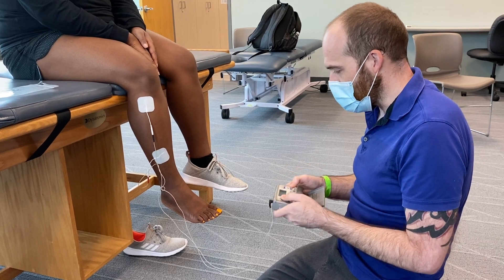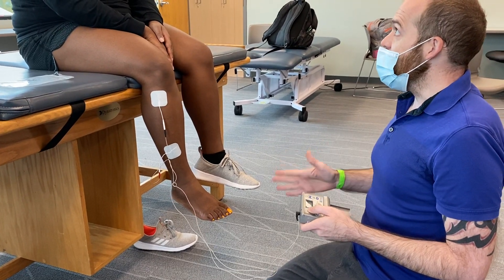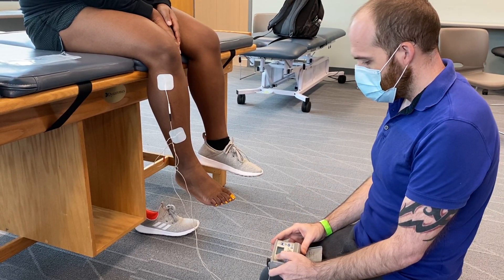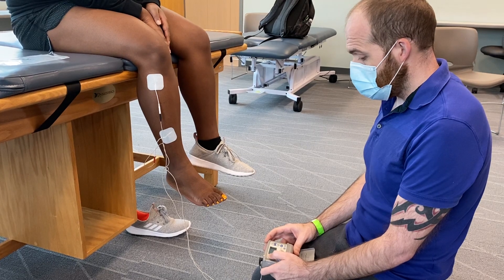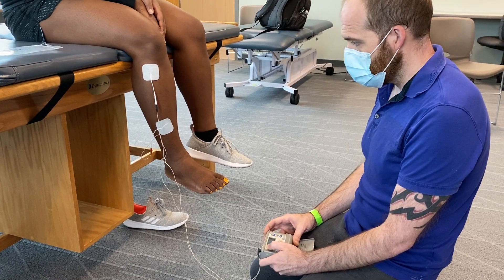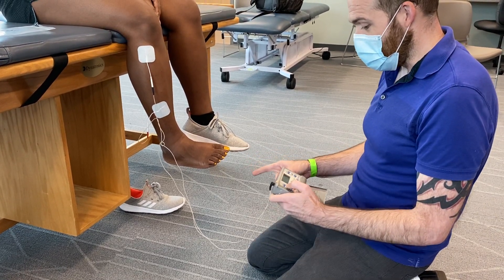Okay, we're ready. What we're looking to see is for her ankle to dorsiflex. For this first one, let's just see what the machine can do. Starting the stimulation — let me know when you feel it. Looking at the ankle — it's dorsiflexing but inverting, and we don't want that.